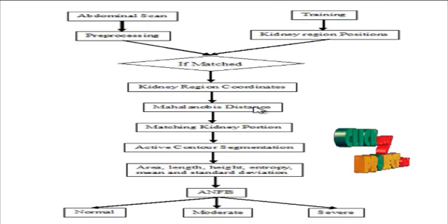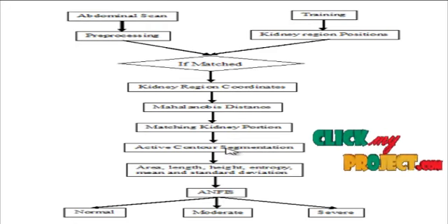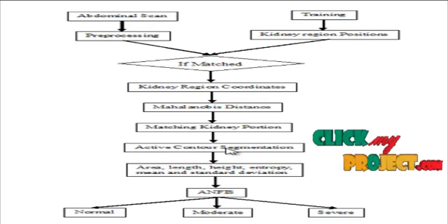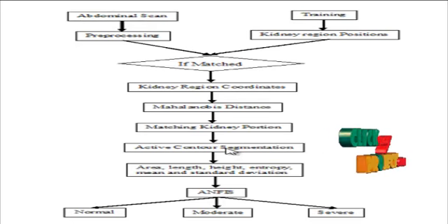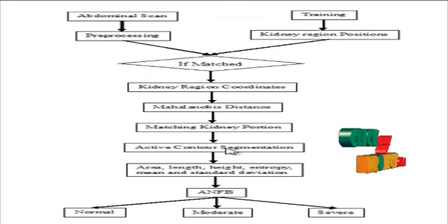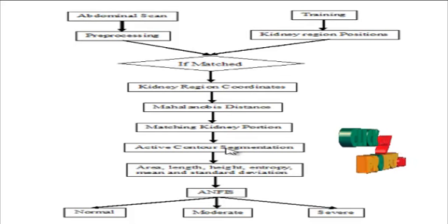For this extraction of the model, the active contour segmentation is employed. The registered portion is applied to the input image, and the registered and matching shapes corresponding to the input images were obtained. The matching shapes here define the positions and the locations of the matching portions in the original image.